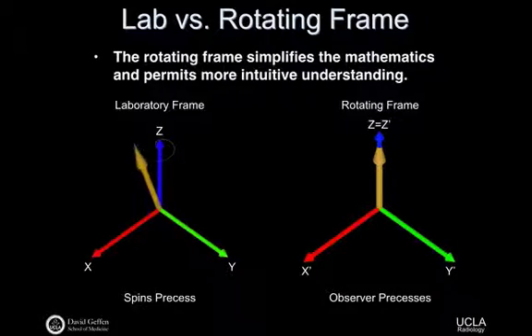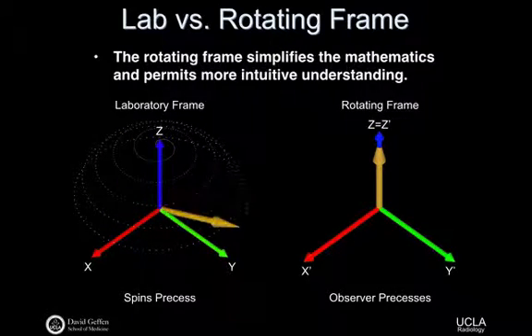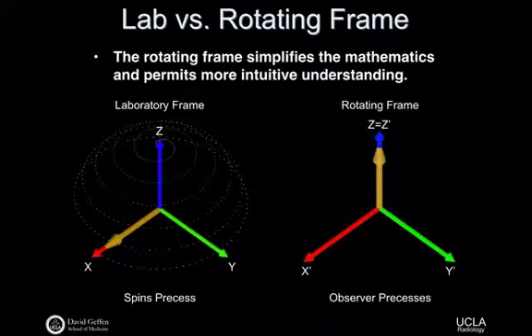This is what I'm really getting at. We've seen this example; this is the third time today. In the laboratory frame, the bulk magnetization maps out this spiral trajectory. We just saw the system of coupled differential equations that would mathematically describe this behavior, and we said that looks complicated, we'll go to the next thing. The next thing is the rotating frame.